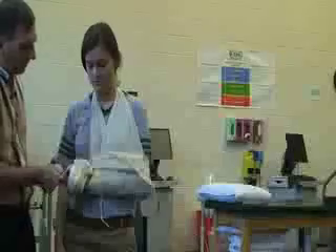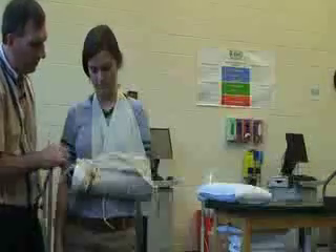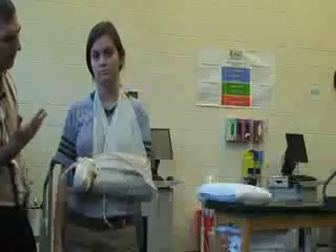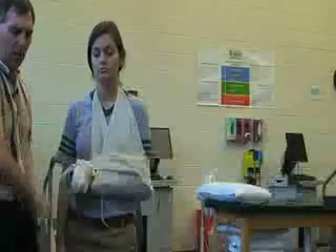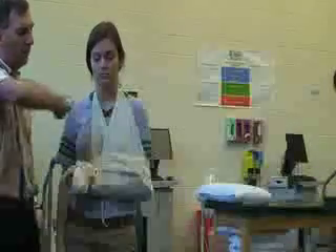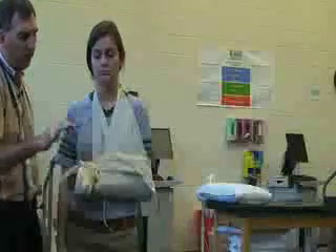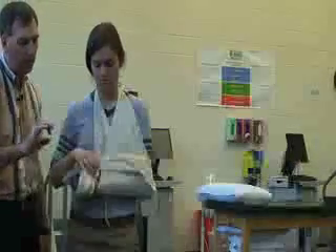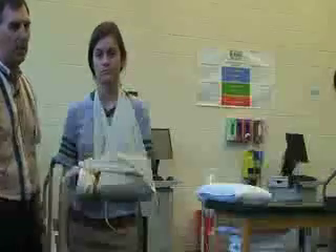The last thing we always want to do is check for distal pulse, capillary refill, and sensations of the fingers. Ask if it's too tight or too loose and comfortable. She should now hold the weight of the arm from going down and it should also keep her from going out. It should also be keeping the wrist up in the position that it was found, so we can transport her to the emergency room.